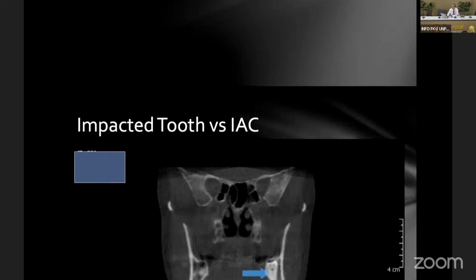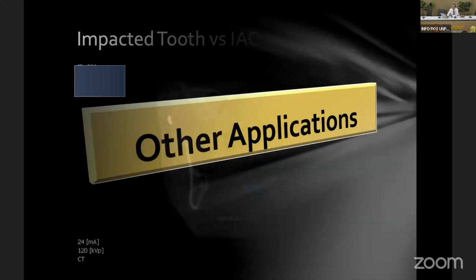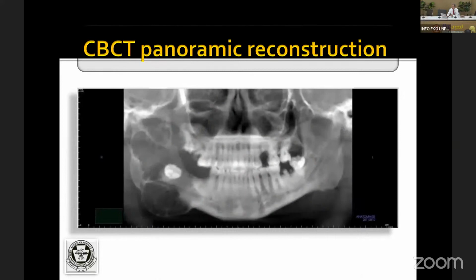For an impacted third molar, certainly we can use the cone beam to see the mandibular nerve and how close it is to the impacted third molar. That's also useful. Surgeons sometimes look at the condyle at different stages; we call it 4D imaging, overlapping different times.